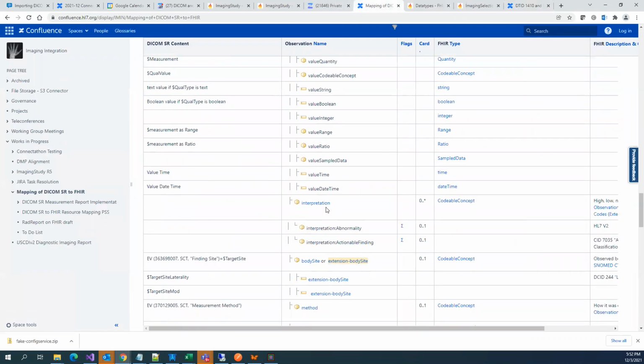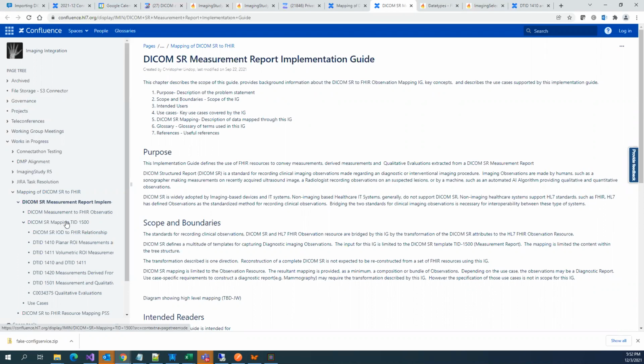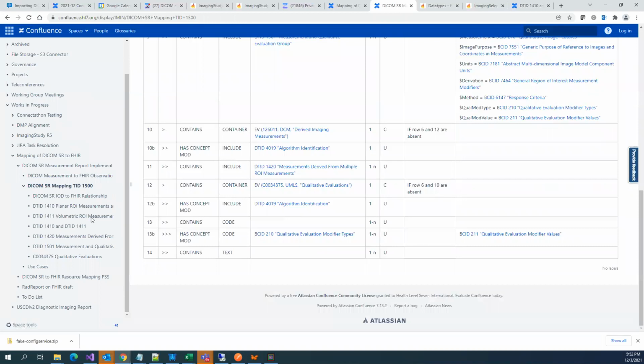Yeah, Anand, so one question. Venu, you said we will create one observation for each value. Is that right? Correct. So that's also what they have defined actually. So if I just go to this as well. So is it for each nodule, or how is it from the postman? So how are they mapping to observation? I just want to know.